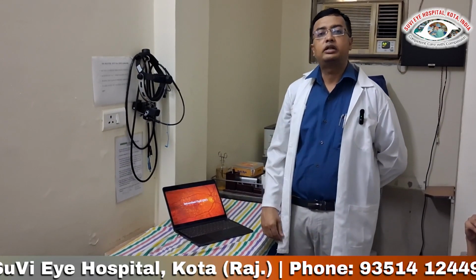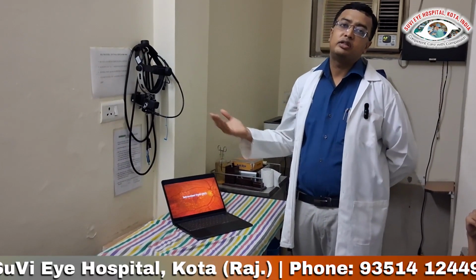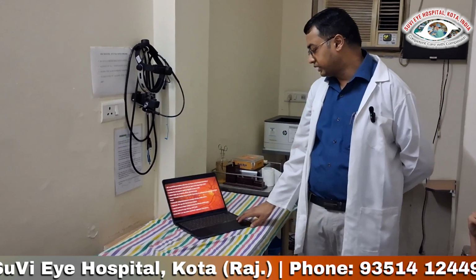And sometimes we can have a mixed kind of picture of CNVM, in which type 1 sub-RPE fluid and subretinal fluid are there. So basically a mixed picture of CNVM with type 1 and type 2, and even intraretinal fluid can be there.